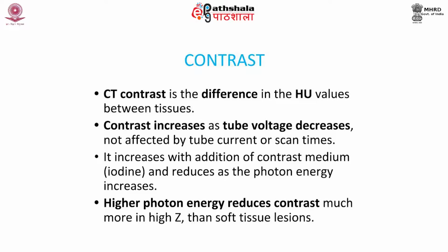Contrast. CT contrast is defined as the difference in Hounsfield unit values between tissues. Contrast increases if the tube voltage decreases, and is not affected by tube current or scan time. It increases with the addition of contrast medium. Usually the contrast medium is iodine, and contrast reduces as the photon energy increases. Higher photon energy reduces contrast much more in high Z materials than in soft tissue lesions.